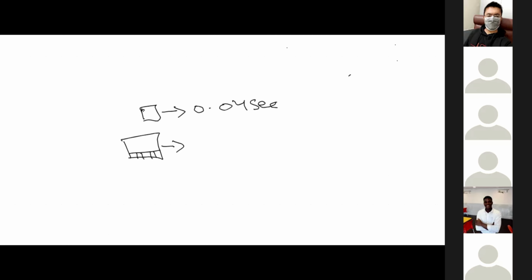That one big box is equal to 0.2 seconds. And as it is an electrical activity, one small box is equal to 0.1 millivolt, right? One small box is equal to 0.04 seconds. That is the representation in time, and this is the electrical representation of whatever is going on. Fine.